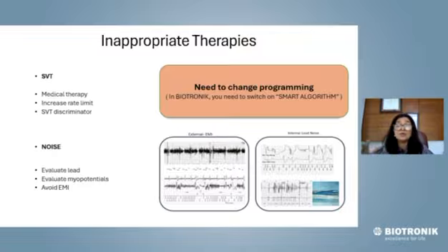There is a percentage that it can calculate to say that this is unlike a sinus, it is not matching the sinus, hence it is a ventricular tachycardia. It could also look at the onset. Is the tachycardia sudden or is it gradual? If it is sudden, it's more likely to be a VT. If it is gradual, it's more likely to be a sinus tachycardia. For supraventricular tachycardia, you just need to do certain programming. And as I told you, it is the most important element of any ICD to understand.